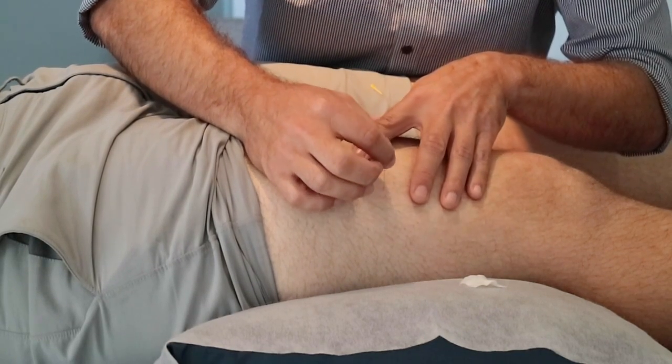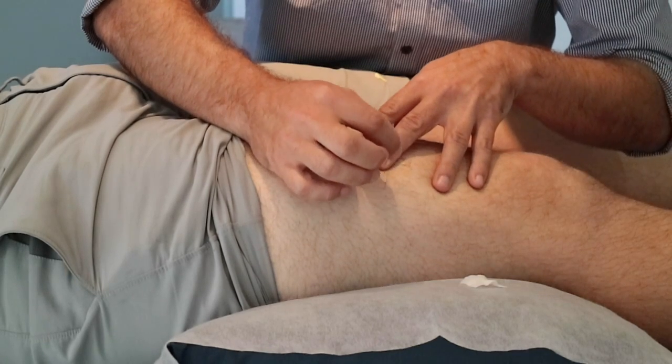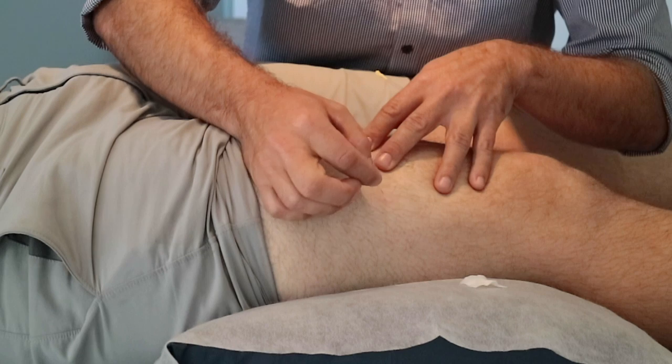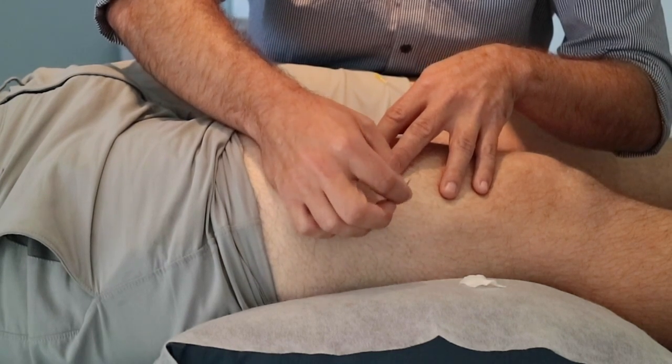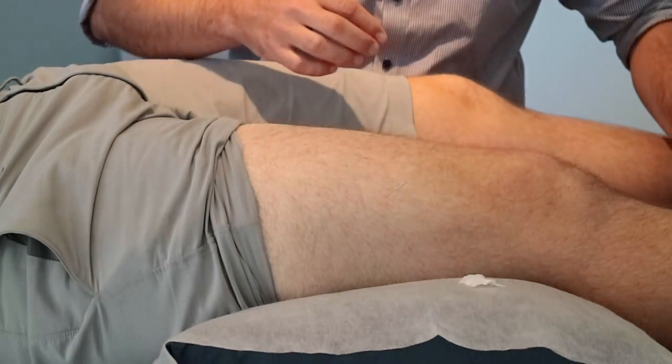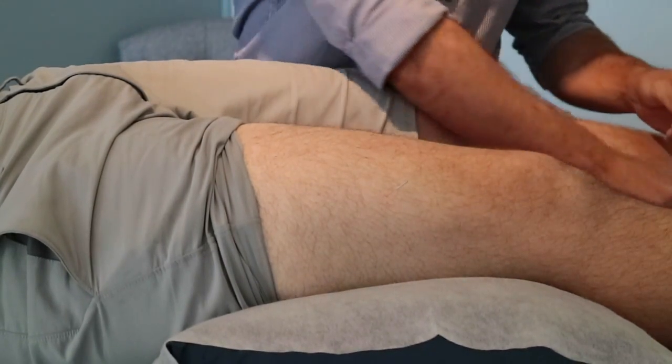I don't know if the camera caught that, but you could see quite a large twitch on this outside corner. And Danny has got some fantastic VL triggers. So they're twitching away, he's loving life, he's having a bit of a giggle to himself, and that's what we want out of our clients. Now we come on to the rec fem.